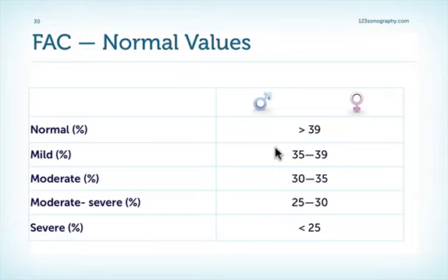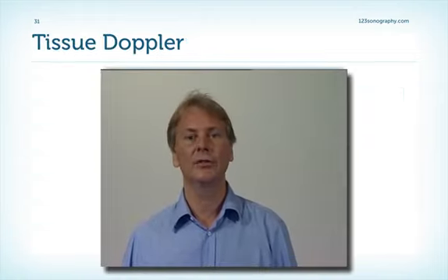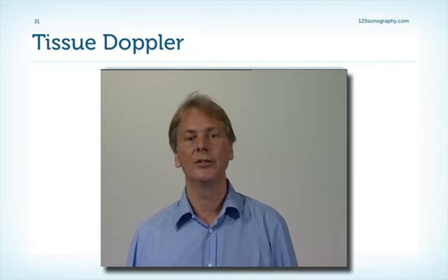Here you see the normal values. Above 39 would be normal, both for males and females. Severely reduced below 25.